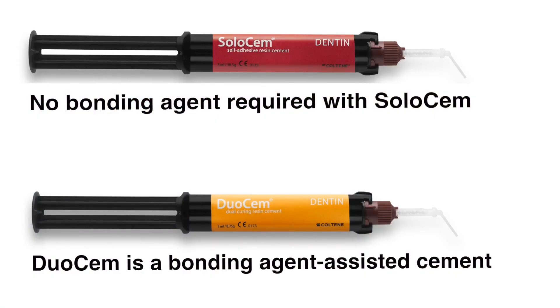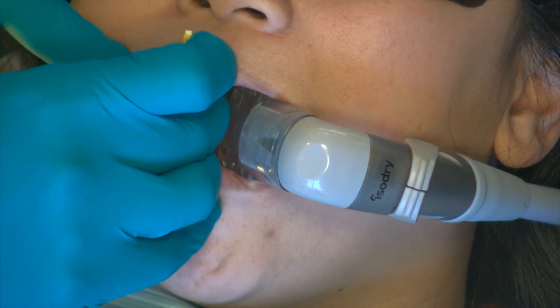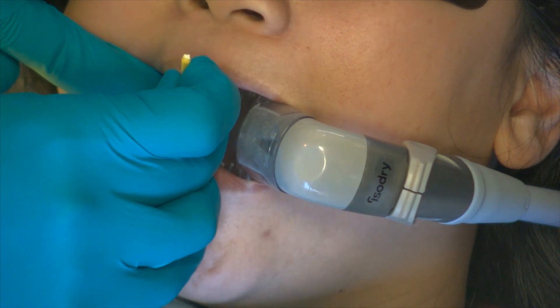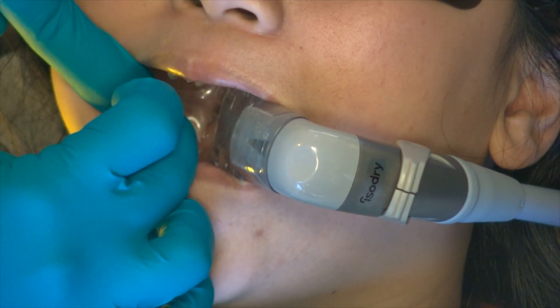Depending on the retention of the preparation, apply a self-etching resin cement such as Solo-Cem or a dual-cure bonding agent assisted cement such as Duo-Cem from Coltene to the internal of the restoration and seat. Remove the excess material and light cure each surface for at least 30 seconds. Once cured, clean the excess and finish your margins.